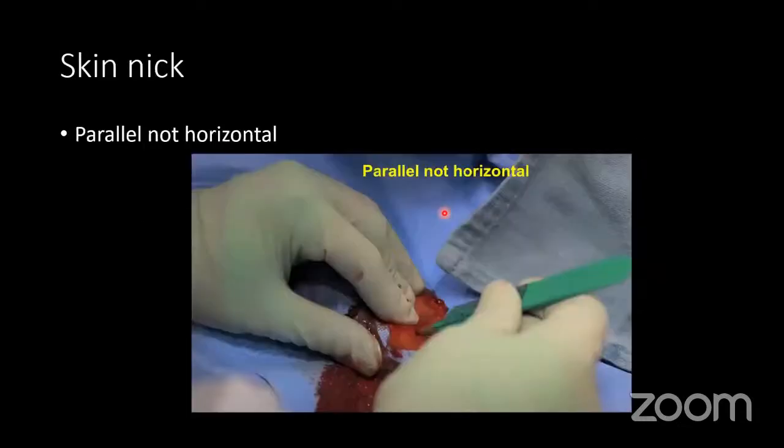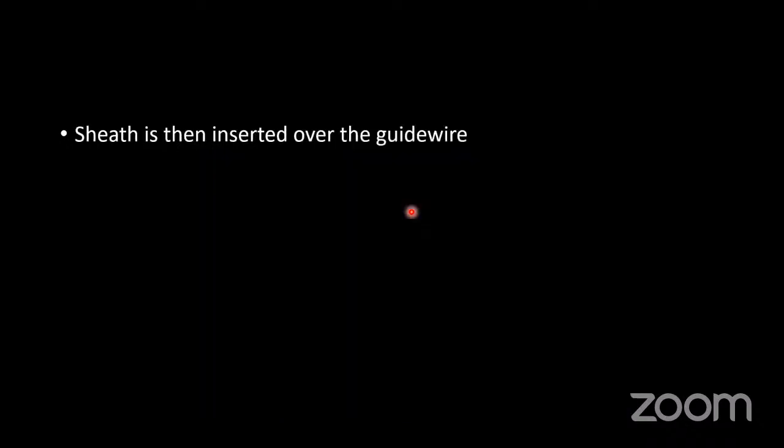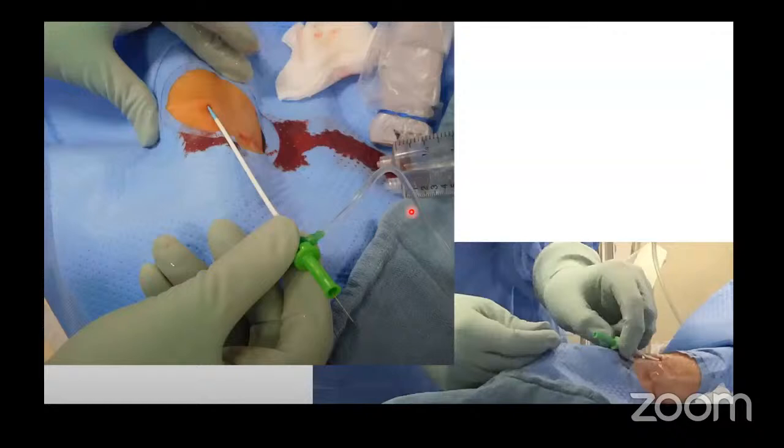Now, after the guide wire is inserted, put a nick parallel to the wire. It is not horizontal; it should be parallel. Now the sheath is inserted over the guide wire. This is how sheath is inserted. Try to hold it on this end, and always make sure that the wire is outside the sheath.